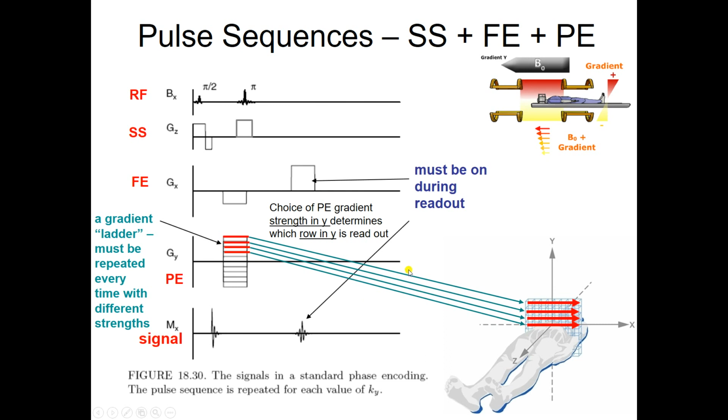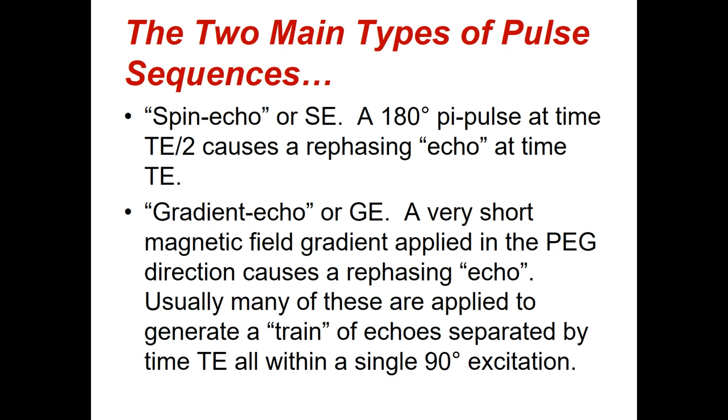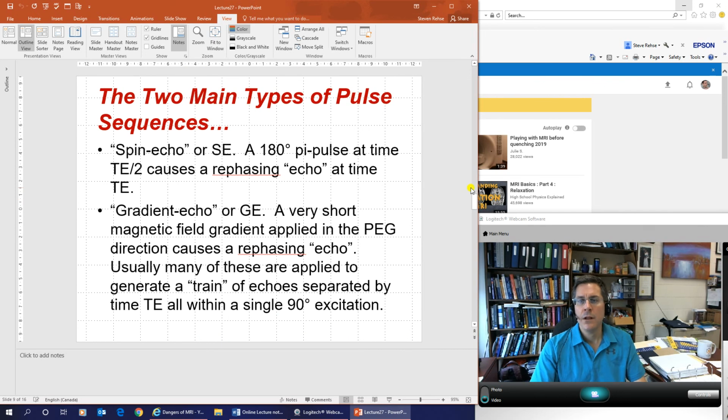So yeah, MR measurements take a little bit of time, but of course the computer handles all of this, and we know that the time for TR is a second or so. So you're doing many, many of these measurements per minute, and that's how these MR measurements can kind of come in. All right. So I'll come back on the screen here so you can see what I'm talking about.